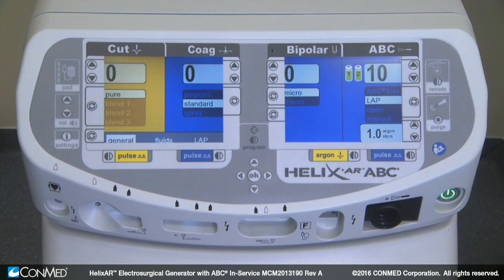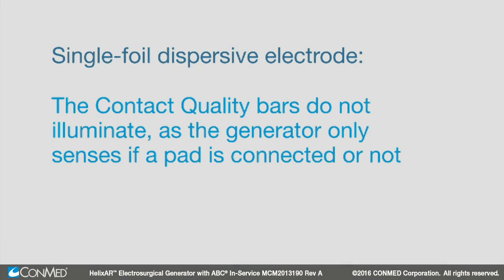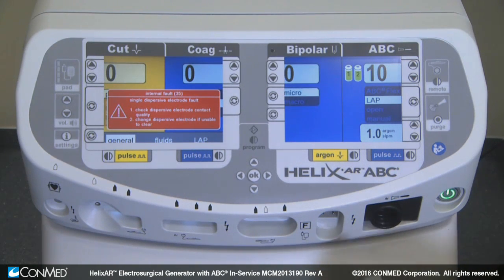When using a single-foil dispersive electrode, the pad indicator flashes red until the single electrode is connected, then it turns steady green. The contact quality bars do not illuminate, as the generator only senses if a pad is connected or not. If connection between the generator and the single-foil dispersive electrode is broken, the indicator turns red, a fault tone sounds, and a visual prompt displays on the generator.